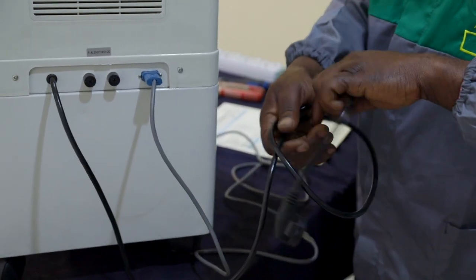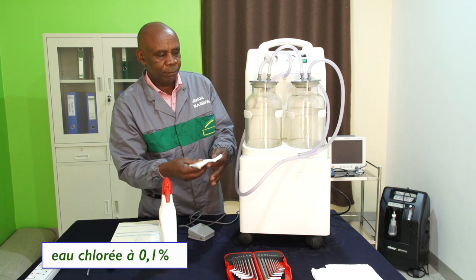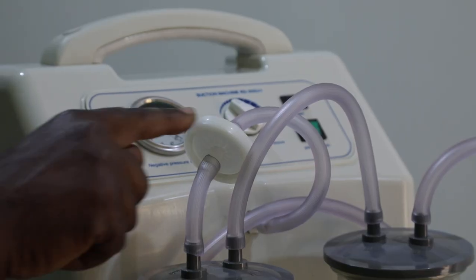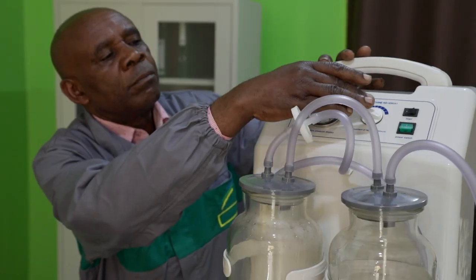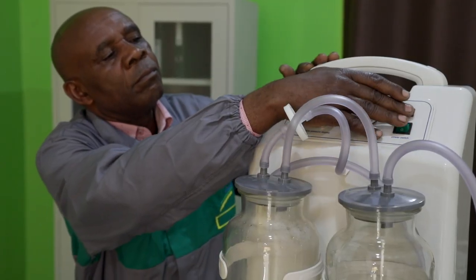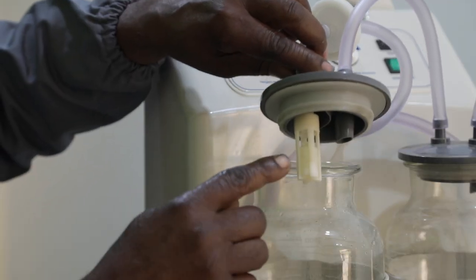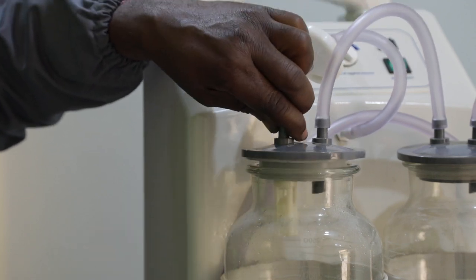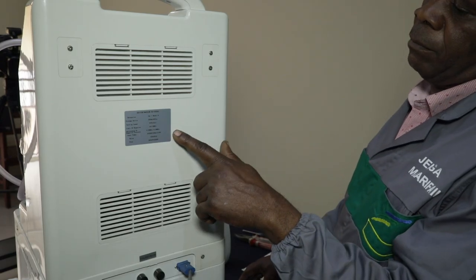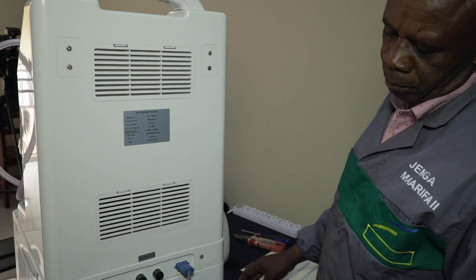On va d'abord nettoyer l'appareil avec un produit détergent désinfectant approprié aux dispositifs médicaux ou avec de l'eau chlorée à 0,1%. Ensuite, on vérifie la présence du filtre antibactérien, du manomètre, du bouton des réglages de l'aspiration, de la connexion à l'alimentation et des câbles secteurs, du bouton marche-arrêt, de la tubulure allant de l'aspirateur au bocal et de celle allant du bocal vers le patient, ainsi que le couvercle du bocal avec son flotteur. On vérifie également que les étiquettes d'avertissement, les consignes d'utilisation et les inscriptions externes telles que la marque, le modèle ou les numéros d'inventaire sont bien présentes et visibles.